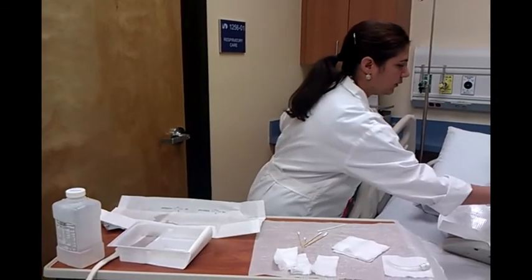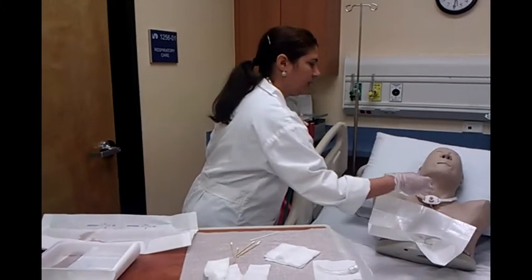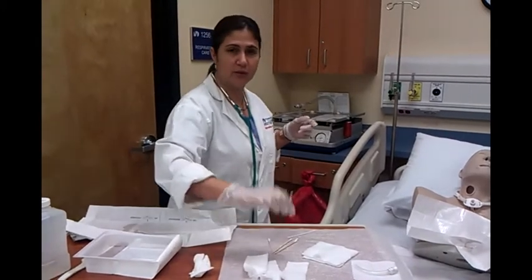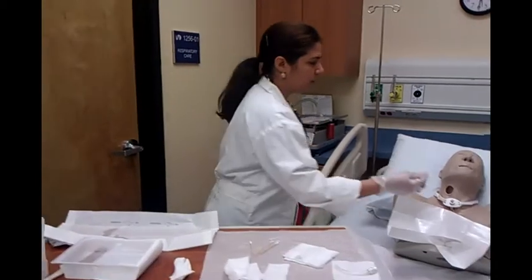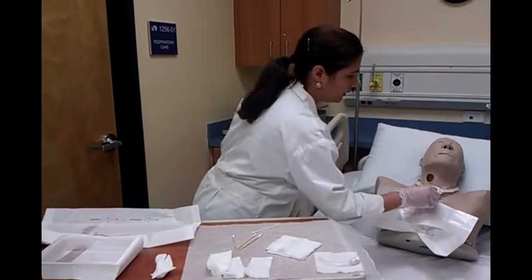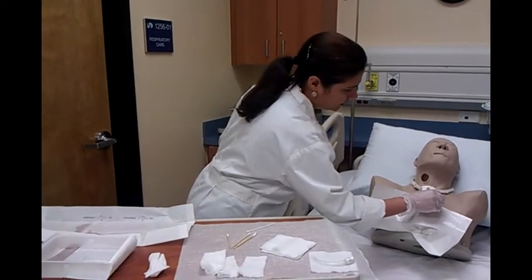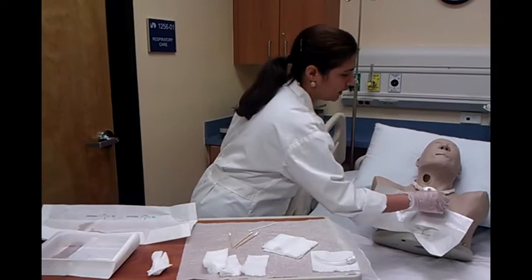Now I'm going to remove the dirty gauze around the flange and the skin, and I'm going to use the Q-tip. I'm going to wet it with water, and I'm going to clean around the stoma and the flange to remove any secretion and mucus.